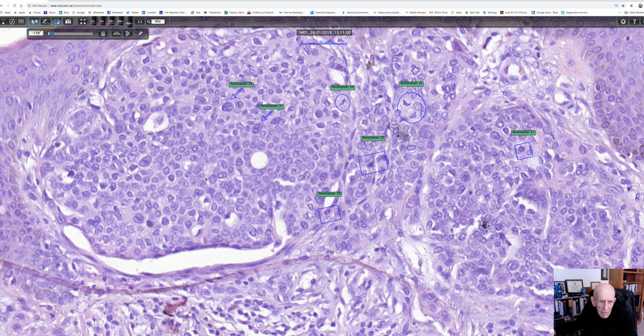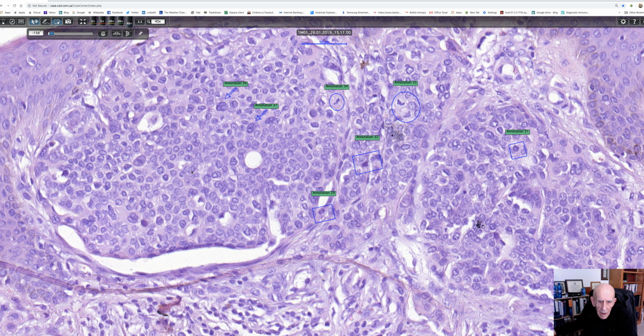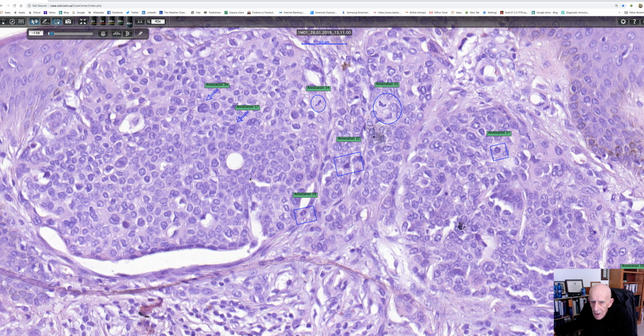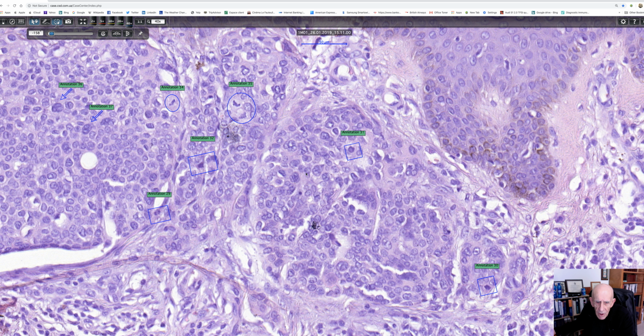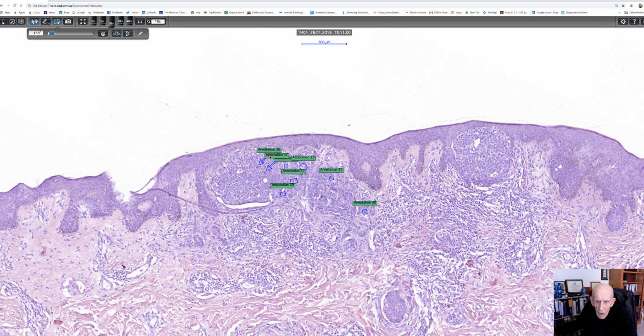So we've got a tumor which looks poromatous, it's very mitotically active, and it certainly does show ductal differentiation. There's not a lot of nuclear pleomorphism, really. It's not a desperately pleomorphic tumor. I suppose there is some variation in nuclear size, and in some cells nucleoli are a bit prominent, but I wouldn't get too excited about it. So let's go back to a low power.